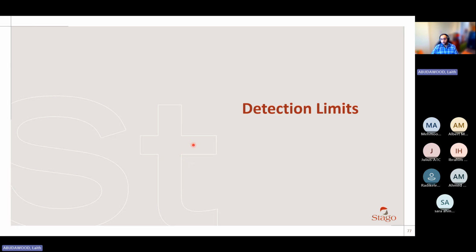Transference comes second to this, because establishment is of course superior, because you are using your own data to calculate your own ranges. If you don't have access to such information, which again would be great to have, then you can do transference.